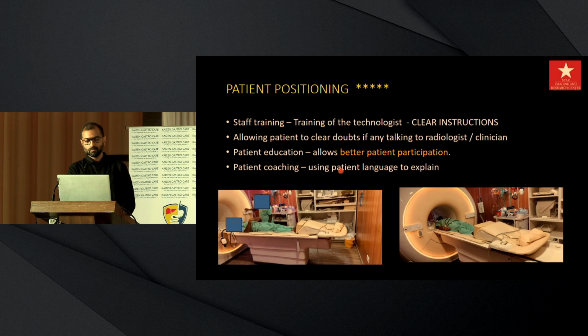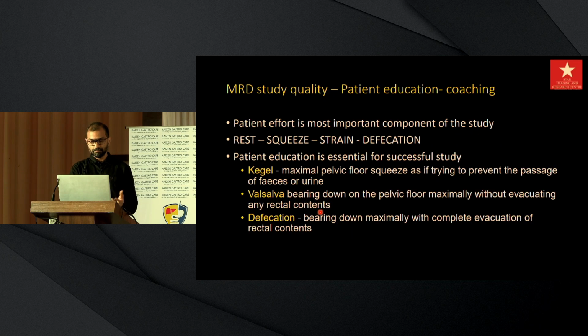These are a few guidelines. The patient may probably require some support below the knee so that the knees are elevated. There also has to be support at the foot end of the patient, because unless and until that is provided, the strain effort of the patient is going to be inadequate. So this is one particular study, as I mentioned, that is completely patient dependent. The entire effort before the study has to be towards training the patient on what all the patient has to do in the MR gantry. This training may take up to 15 to 20 minutes for the patient to comprehend what exactly is to be done during the procedure.